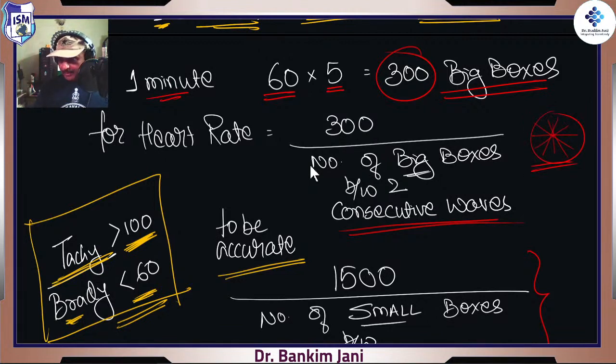Because the moment it is asked, which lead is perpendicular to, let's say, lead 1, immediately you'll be able to say that it is AVF. It has importance. That's where, when I want to watch the heart in an X-ray chest, you watch it from the PA view, and then you have a lateral view, so that you can pinpoint exactly where this particular substance is located, because you are watching it from two angles. Here you have 12 angles.